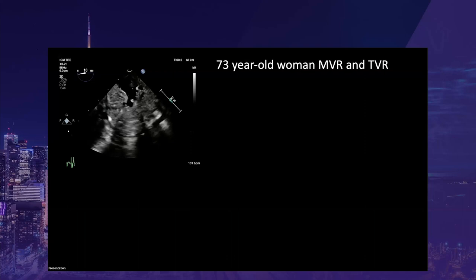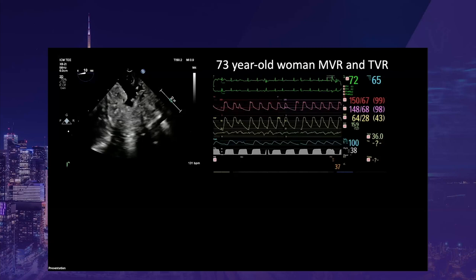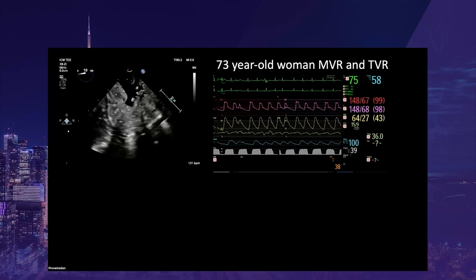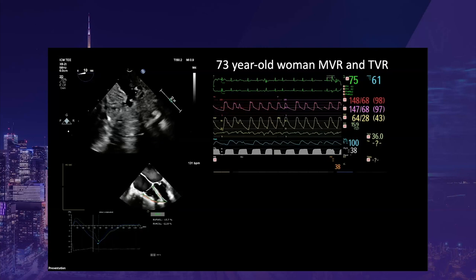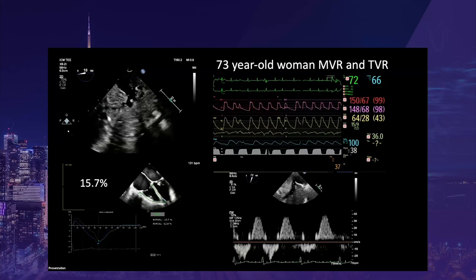This case demonstrates how we can integrate all this information. A 73-year-old woman with heart failure secondary to mitral and tricuspid regurgitation was referred for mitral and tricuspid valve replacement. The stomach appears severely edematous on transgastric view secondary to venous congestion. Pulmonary hypertension is present on the pulmonary artery curve, and central venous pressure is elevated with a permanent V-wave. On mid-esophageal four-chamber view, both atria are dilated and RV dysfunction is present with RV free-wall strain of −15.7%. Accordingly, hepatic vein Doppler is compatible with severe TR and RV dysfunction, with the S-wave completely reversed.